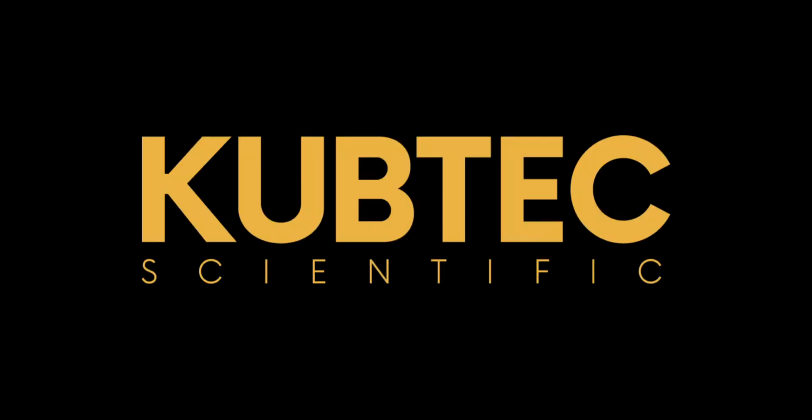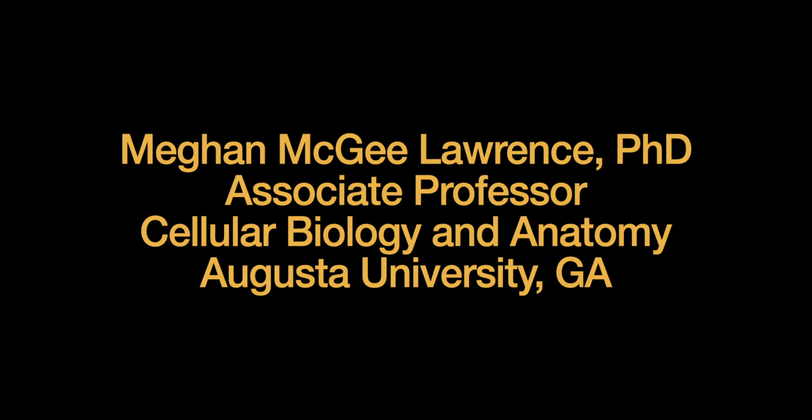Now we'd like to present Kubtec customer testimonials. These valued customers will walk you through their experience using the Kubtec systems at their facility.